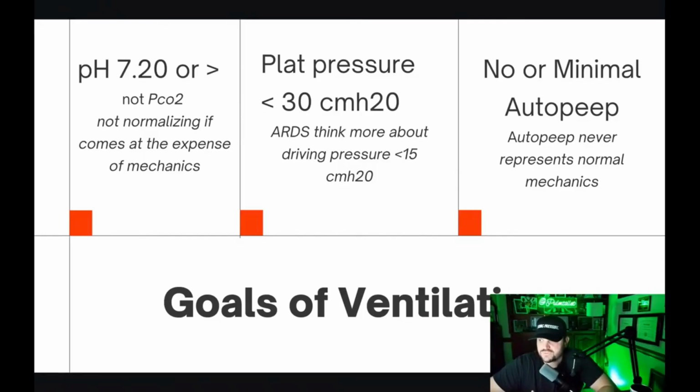So that's a problem when the patient's just riding the ventilator. If you're set at 20 and the patient's breathing at 20, but not triggering any breaths, that's an issue, because that's going to lead to diaphragmatic dysfunction and ultimately more time on the ventilator. So while I think about driving pressure in normal ventilation, if the patient doesn't have ARDS, it's not really applicable, unfortunately. And I'm going to get probably a lot of heat for that, and that's fine. But that's the state of the evidence right now, that it's not really applicable at this point.